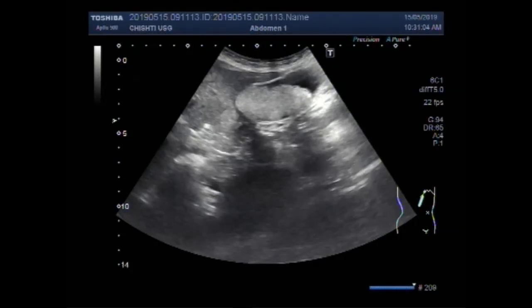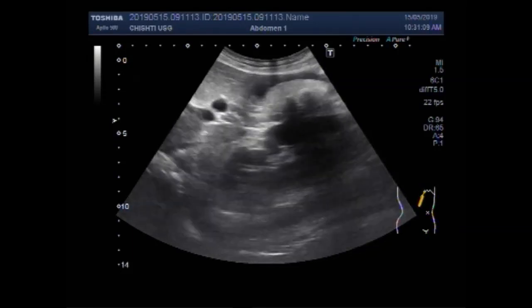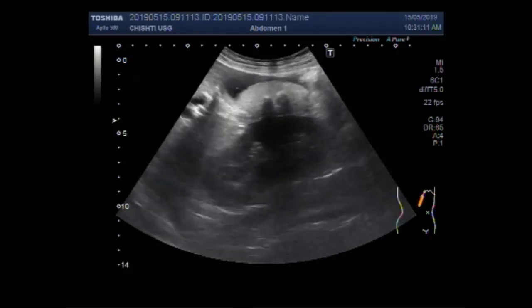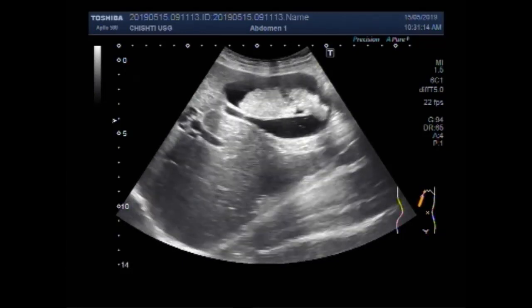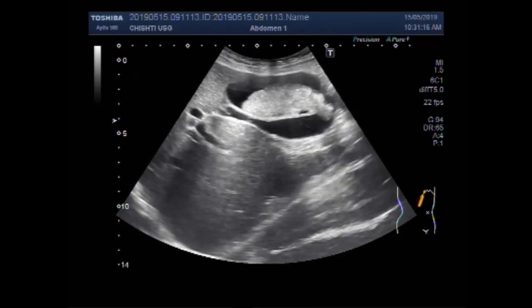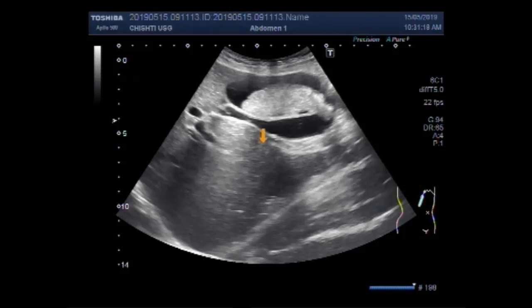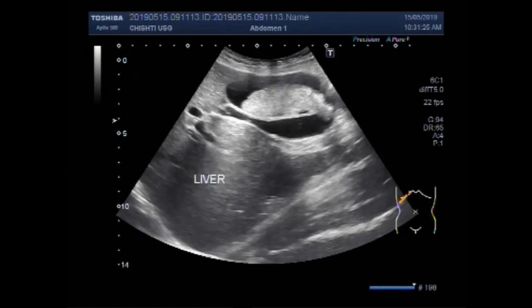Dear viewers, I hope you are all fine. This ultrasound video shows a large amount of thick sludge and a sludge ball in the gallbladder. Some gallbladder stones are also impacted inside the thick sludge or sludge ball.